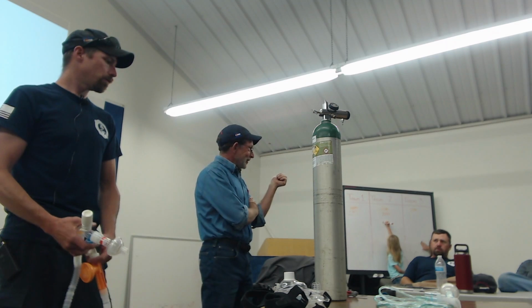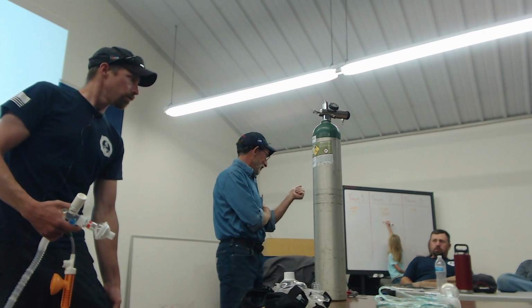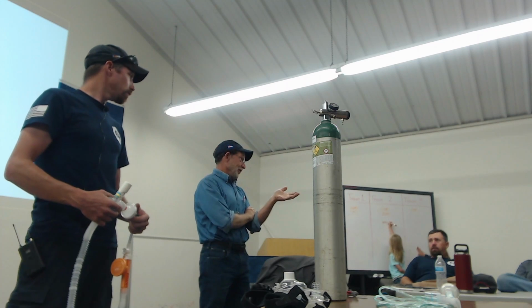And along those lines, I've been asked frequently, when we talk about one of the primary reasons that we're going to go to CPAP is because we've got your non-rebreather and you've dialed it all the way up to 15 liters, what's the percent FiO2 with a 15-liter non-rebreather? What would you guys say that is? Probably 90, maybe 88, 90, something like that. So if you're giving that non-rebreather at 15 liters, you've been giving them 90% of inhaled oxygen.